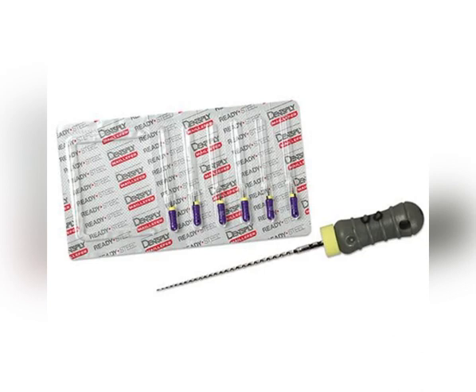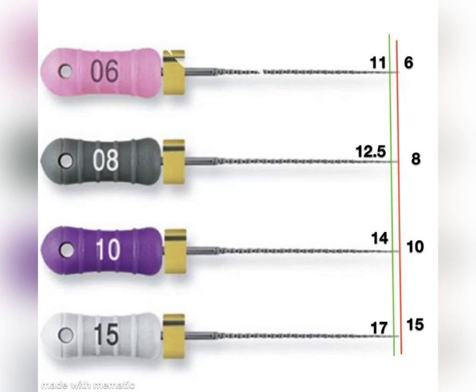These files have a greater taper. Unlike the constant taper files, when you see the C Plus files from D0 to D3, there is a greater taper, which differs with size 6, 8, and 10. The plus signifies that the tip is active, which means it can walk through the calcifications, or just squeeze into the calcifications, but you should be very careful. That is there. So I want to tell you about the taper of the files.